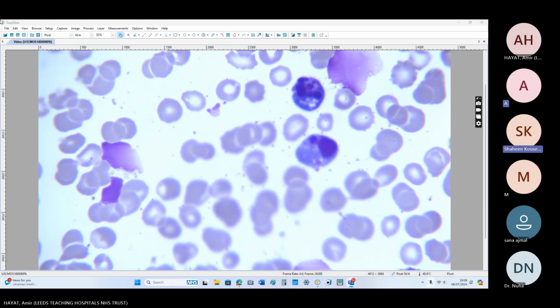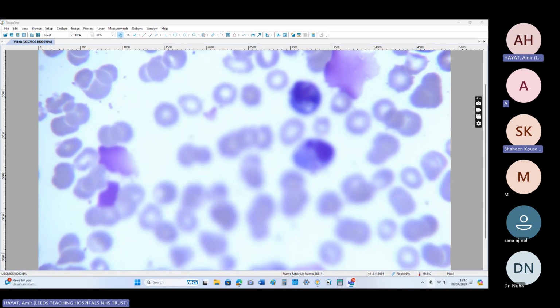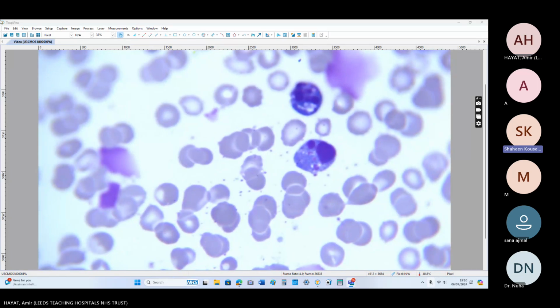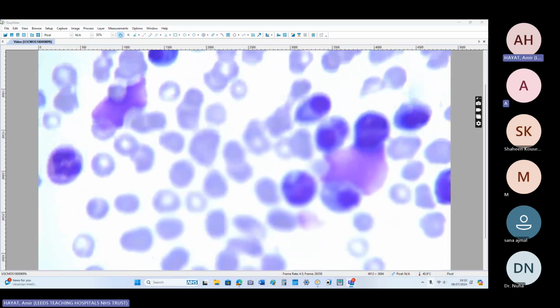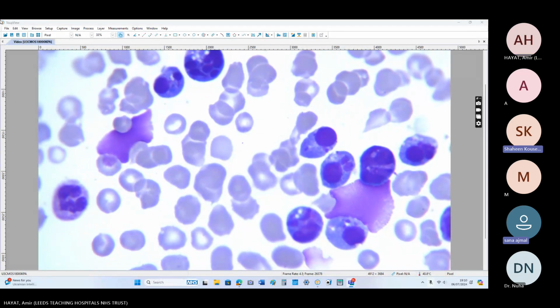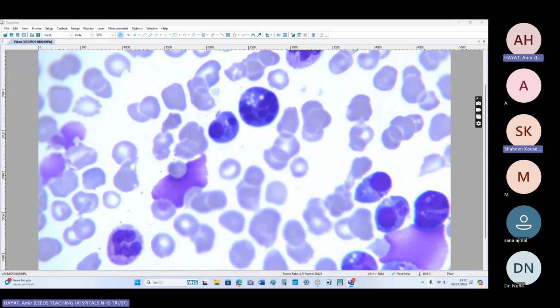They are very bizarre looking. There are some cells which are multinuclear, maybe dying, apoptosis. A lot of mitotic activity is going on because this is a high grade tumor. But mitotic activity in a peripheral blood smear to this extent I've never seen.